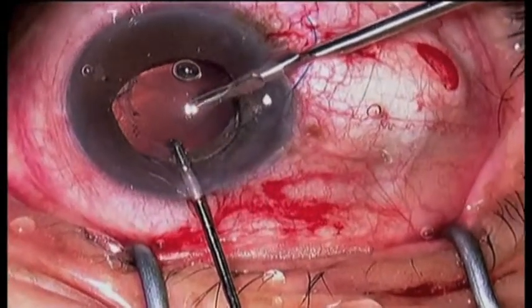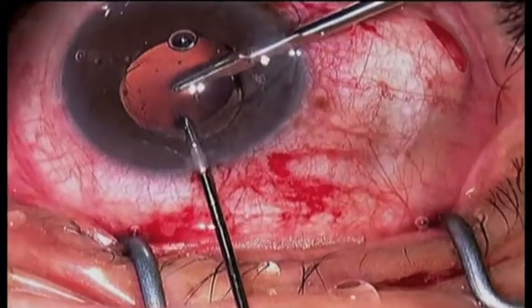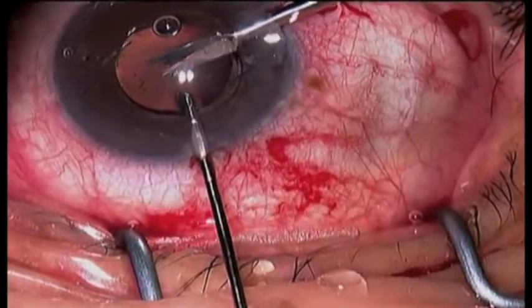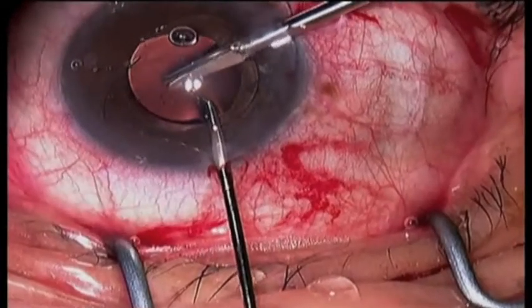This is a very hard material — it is the Sensar acrylic material — but the scissor cuts through it relatively easily as long as it is held securely in the other hand with the forceps.